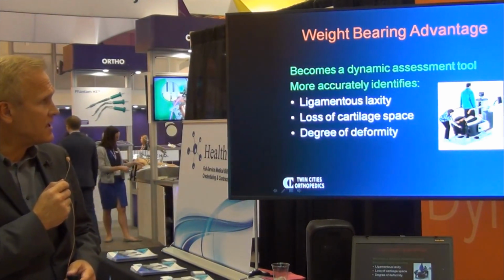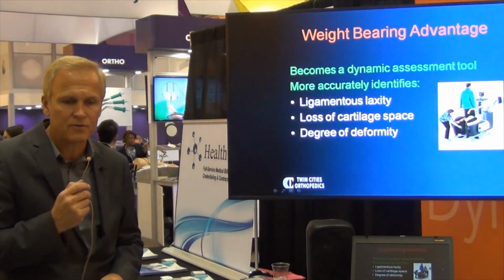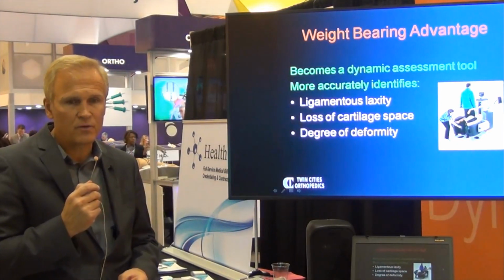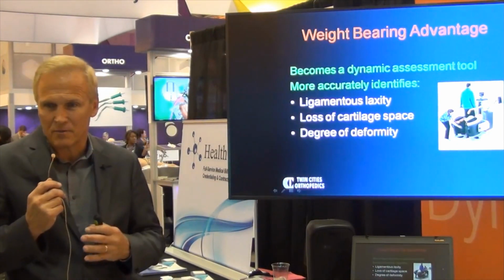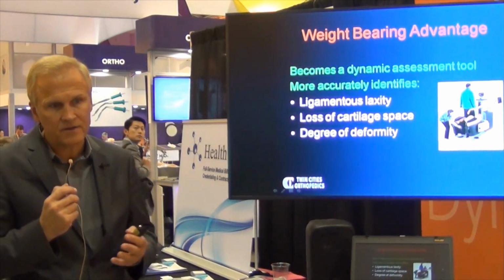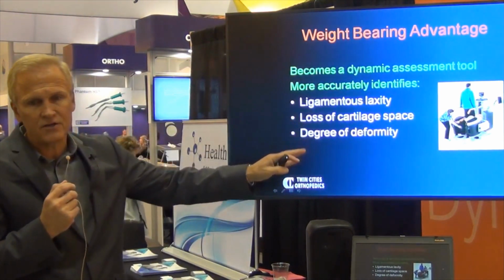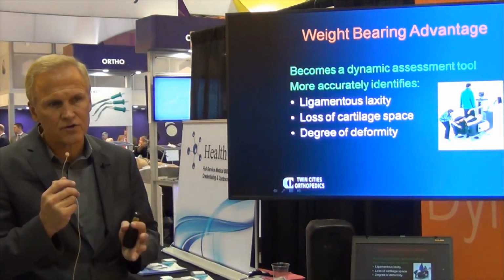So the weight-bearing advantage, again, I talked about this before. The ligamentous laxity issue is really an issue with us. Most of us know when there's a posterior tibial tendon rupture in a patient, but is the deltoid intact? Is the spring ligament intact? And again, the weight-bearing part of an examination is very important to help us sort out as surgeons.